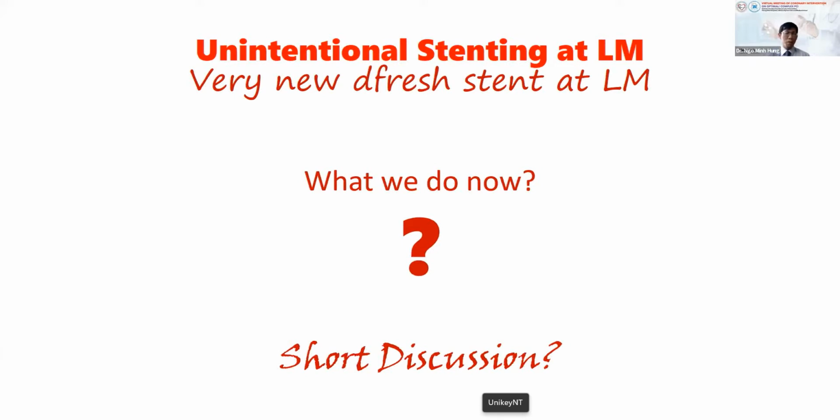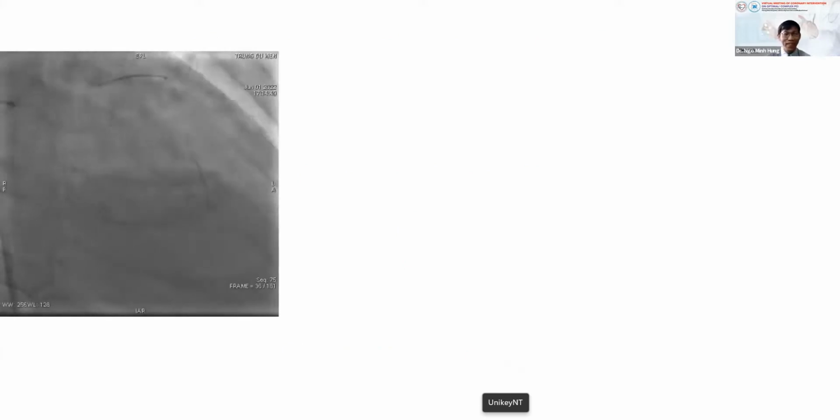Thank you very much. Okay, thank you. I did the same as your suggestion. First, I like to try rotational atherectomy so much, with a RotaWire.